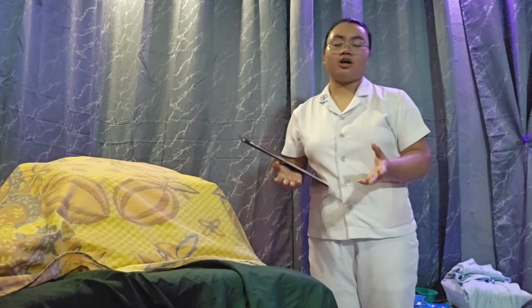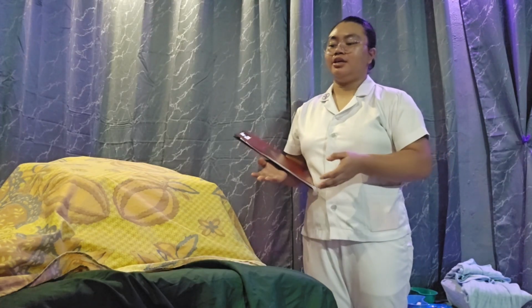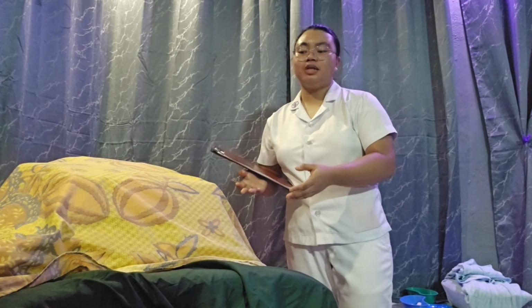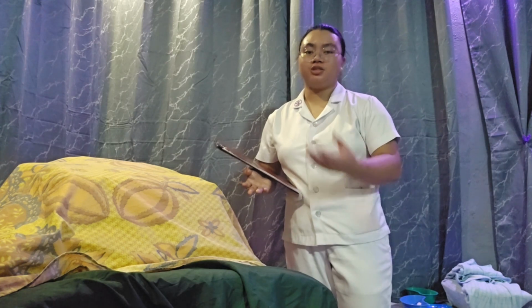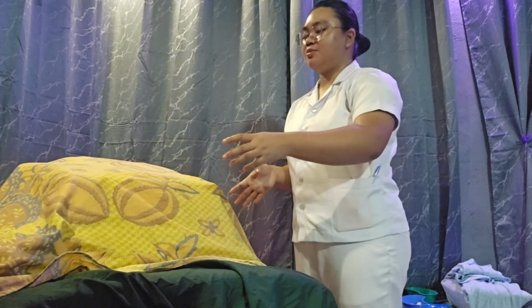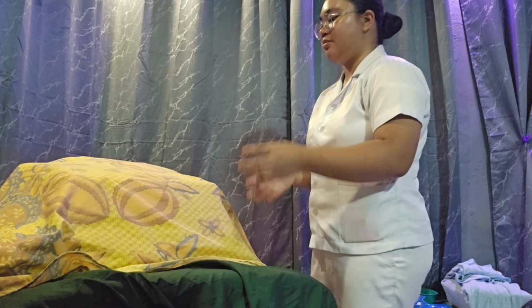So after providing privacy to the patient, we are now going to position the patient in a dorsal recumbent with knees flexed. So this would allow us to easily visualize the area that we are about to do the procedure. So ma'am, I need you to lie on your back and your knees flexed po, and then feet wide apart, so that I will see and do the procedure effectively and properly po.